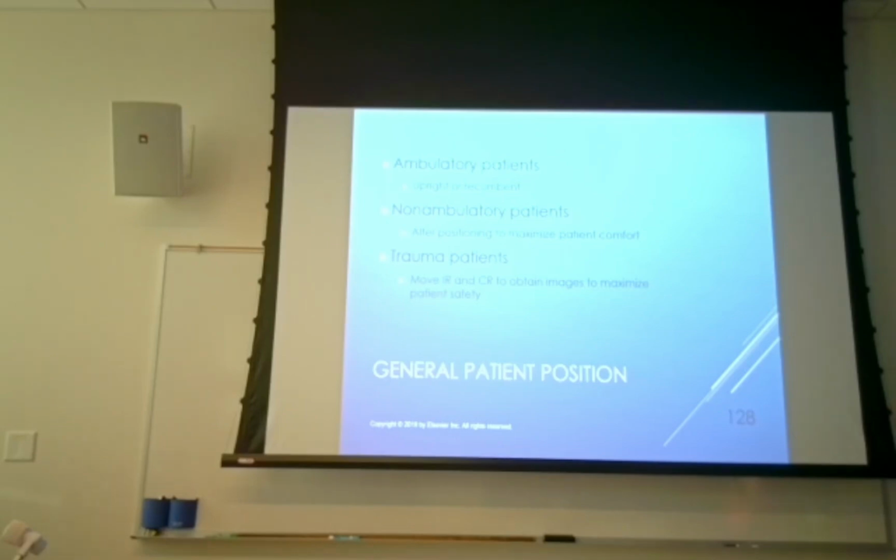So chest x-ray is always our first one, and the chest x-ray is going to be our T-spine too. Likewise, in the L-spine, even though it's not as urgent, if we shoot a KUB on a trauma patient, the KUB becomes the L-spine too. That makes sense. Okay.